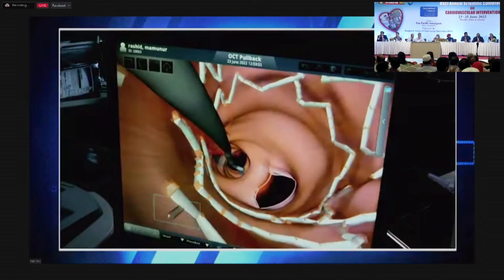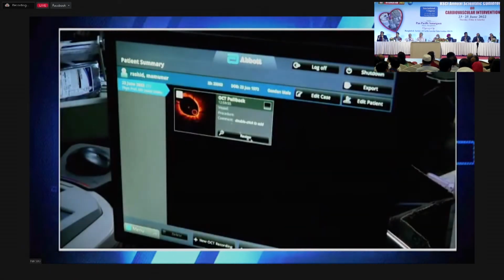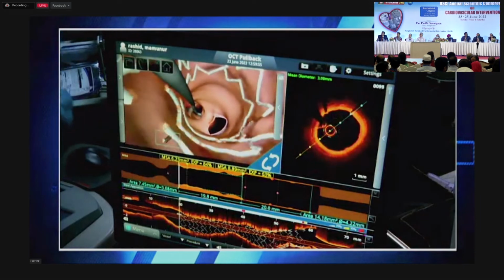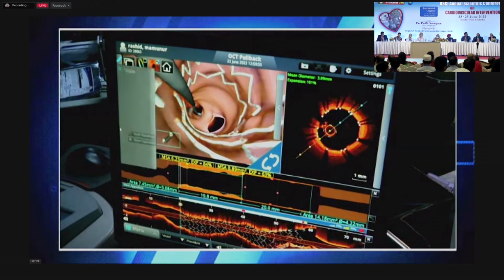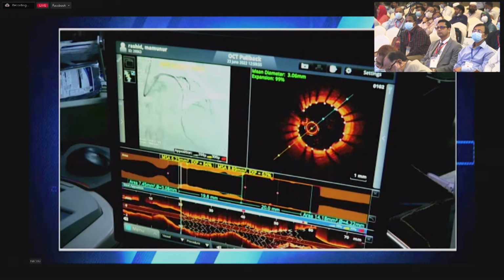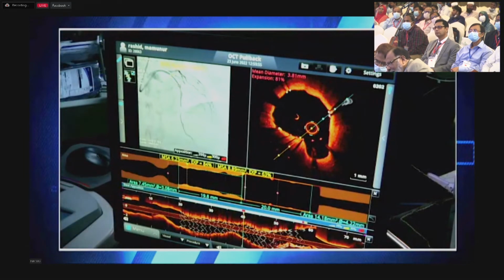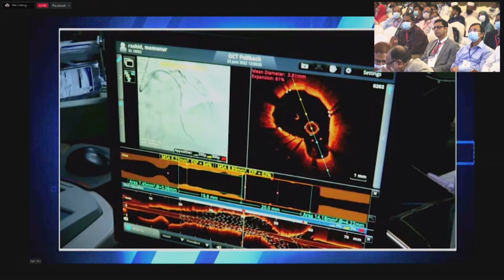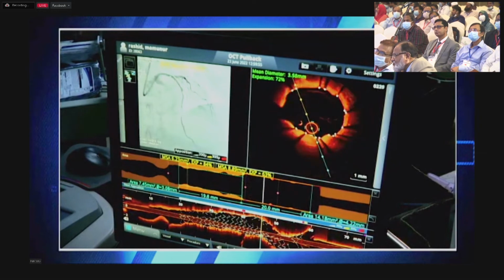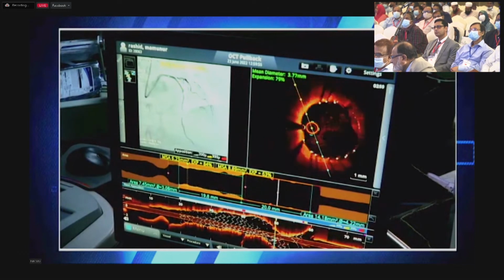Okay, after this, all right. Adequate post-dilatation, and there is no edge dissection, and there is no under-expansion. We do not see any red marker, all are the same. And only two, three struts maybe within 300 micron. Yeah, at this one there is a branch. You see, there is a branch, and that is why it looks like under-expansion. Adequately inflated, well inflated, and there is no residual stenosis.